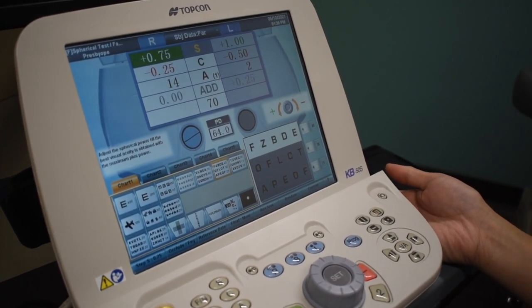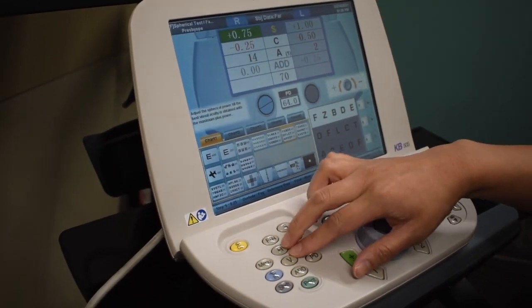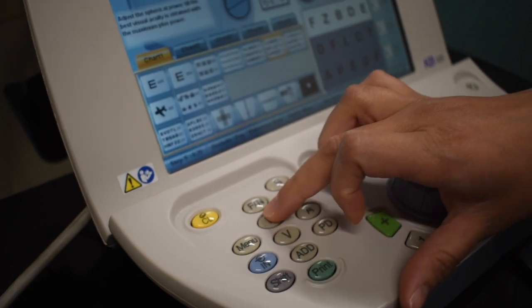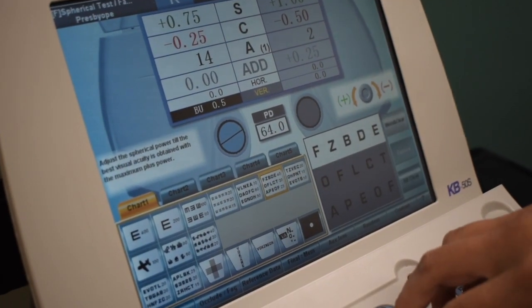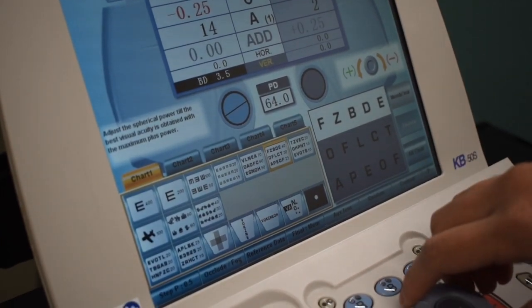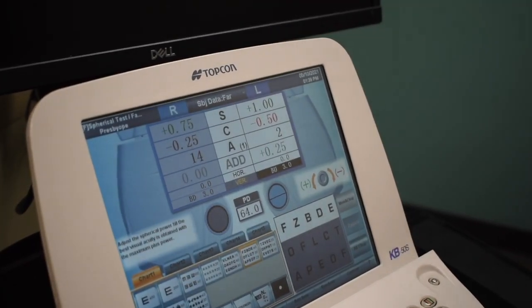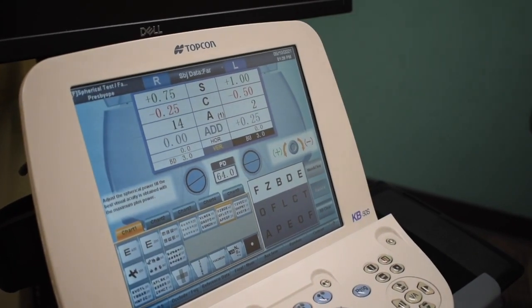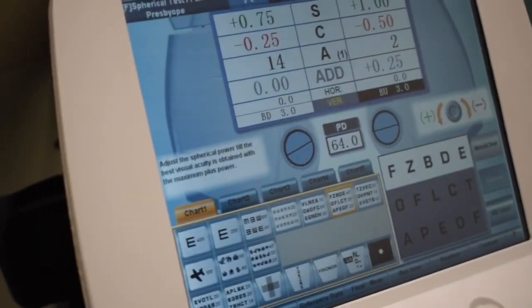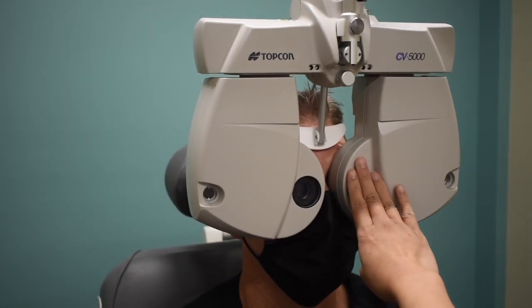Since he's 2040 blurred, we are going to jump to the distance equalization. To do that, we're going to put in some prism — bringing up the prism by pressing H or V for horizontal or vertical prism. I'll click H here. Going down to the vertical prism line, we're going to put in three base down for his right eye and three base up for his left eye. Opening up both eyes — you're going to see two lines of letters, both blurry. Do you see two lines? Confirming: covering right eye, top line disappears; covering left eye, bottom line disappears.